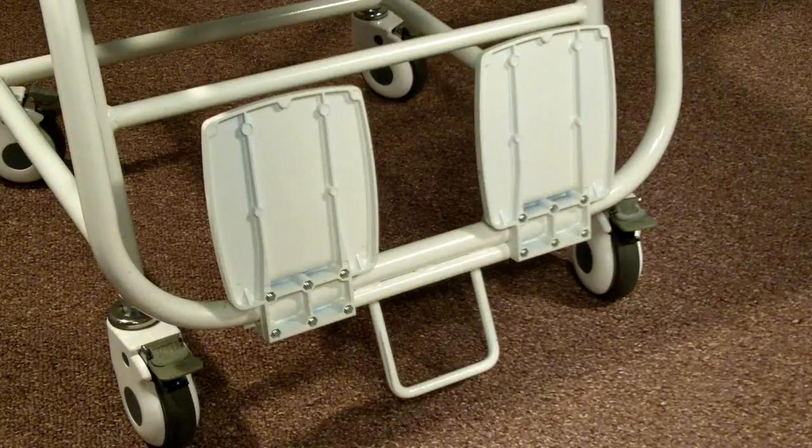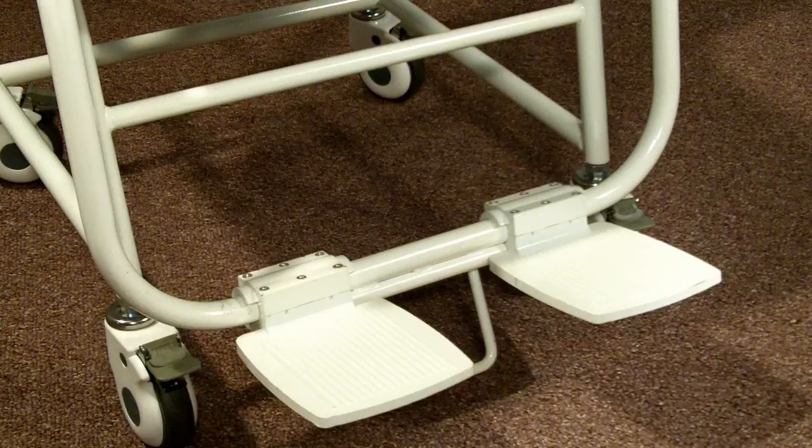The large foot rests can be folded up and out of the way when the patient enters and exits the scale, and they can be folded down when the scale is used to weigh the patient. With the patient's feet on the foot rest, an accurate weight is ensured.